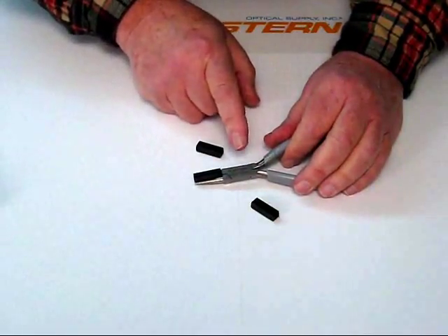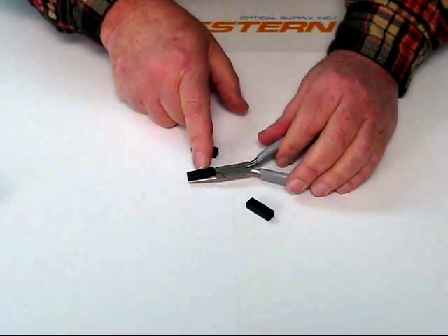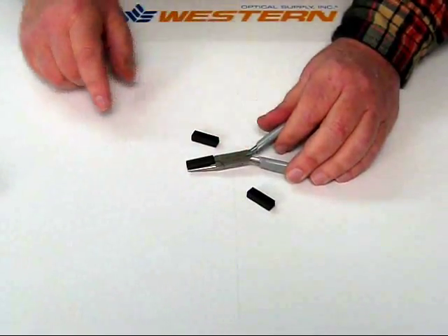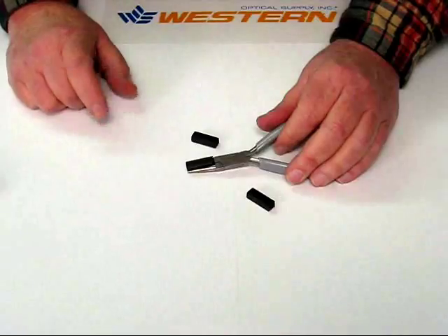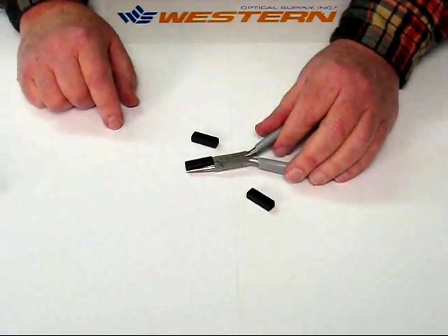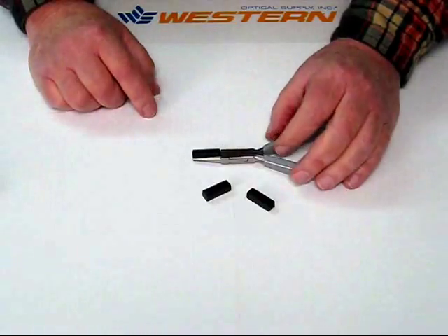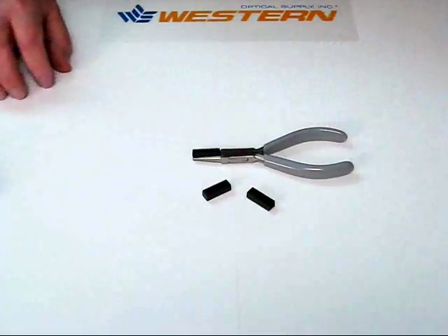The other feature we have that you probably can't see is that on every plier that requires a pad, we have noted the replacement pad number. So we're not going to be sending you the incorrect pad — you're going to order the right pad each time. And that's the information about our Delrin replacement pads that are on all of our pliers. Thank you.